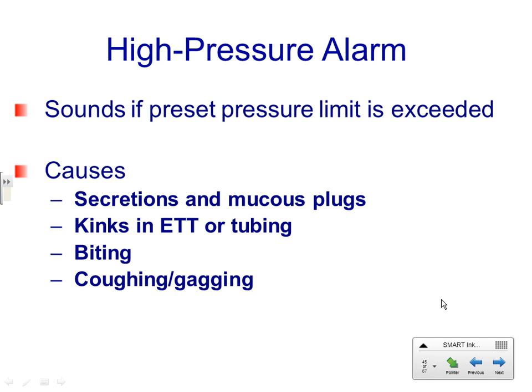Don't assume if the cardiac monitor says flatline that your patient is dead. Look at the patient, and they may still be sitting there talking to you, and it could be a malfunction of the monitor. Same thing with the ventilator. If the alarm's going off, check the patient, because that's going to tell you what's going on with the patient, not what the readings might be on the ventilator settings.